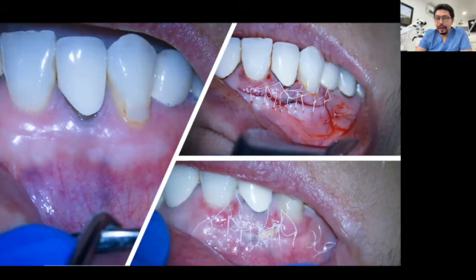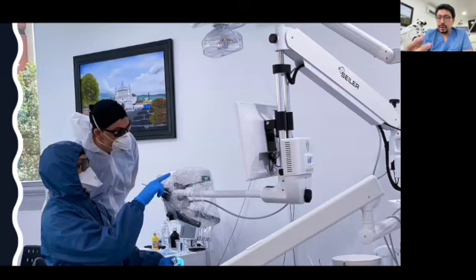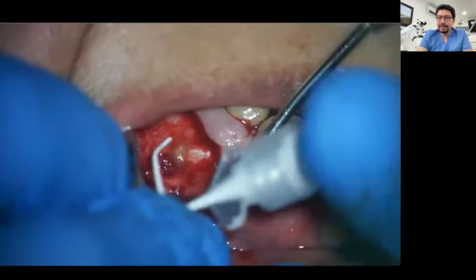And we are able now to see that because I took that picture in high magnification. Otherwise, you don't even look at that. And when you work, I do my periapical surgeries working with my wife. You have your colleague just beside you seeing what you are doing. And you can have an exchange of ideas in real time and analyze what you think. Maybe it's better to go in this way, it's better to go in the other way. Two heads always think better than one, and you can have that communication at the same time.